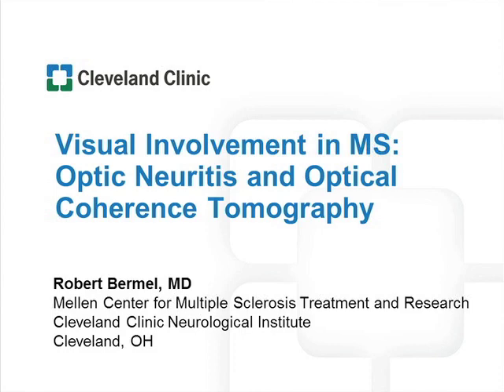The cases you showed emphasize the central role of MRI in monitoring for the likelihood of MS and even for the presence of MS at first optic neuritis presentation. Optical Coherence Tomography has rapidly become disseminated as a non-invasive, useful technology for back-of-the-eye disorders. We can now use this to help us monitor macular edema developing with fingolimod treatment, a key step in patient safety with a useful but complex medication.